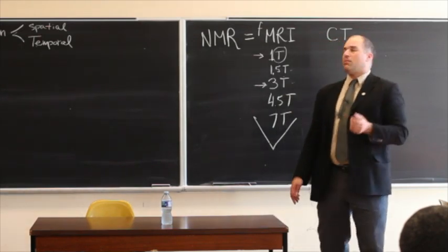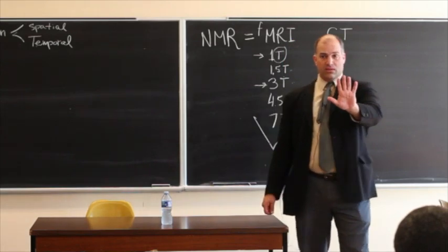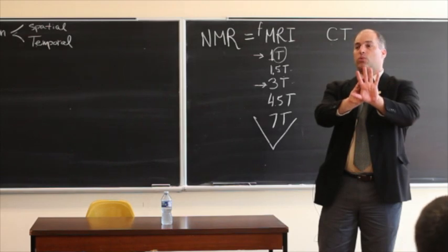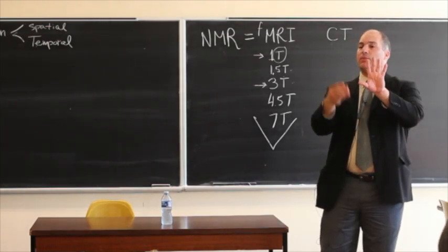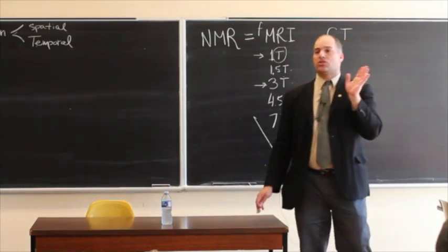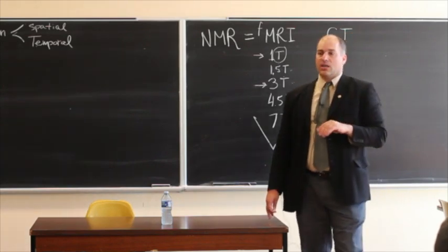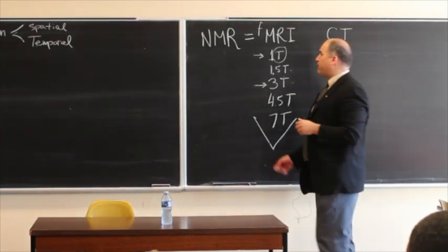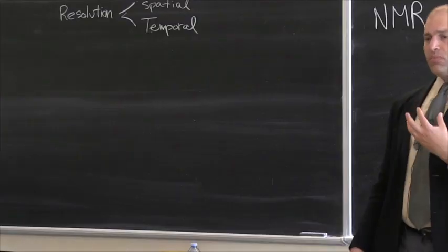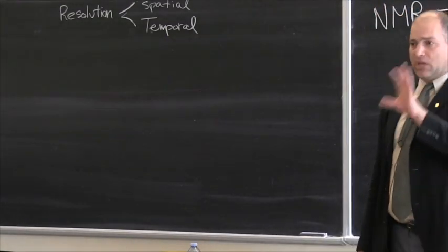When you're looking at functional MRI, you can actually take an MRI snapshot of the brain, and then superimpose on that a functional image that would come from changes of the blood as a result of a particular cognitive challenge that you're giving the person, or even no cognitive challenge, just let them sit there and relax. Now, this is very important. This is a big innovation. Before, we only looked at still images of the MRI that were coming from structures, and the blood played very little, if any, role. I mean, in some cases it could play a role, but in general it doesn't.